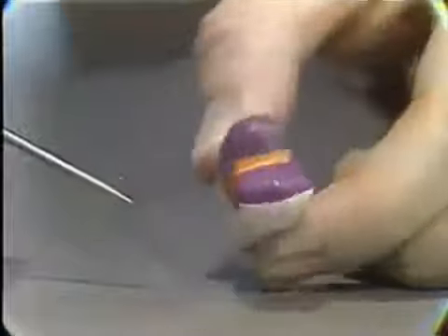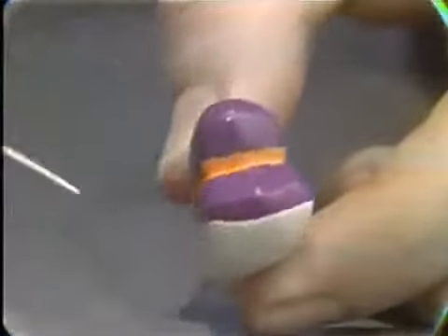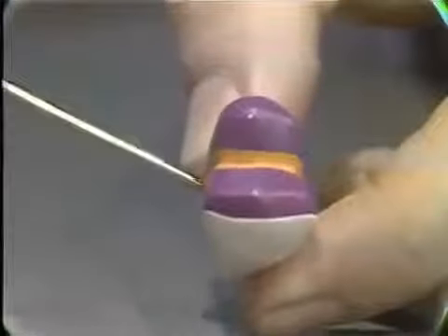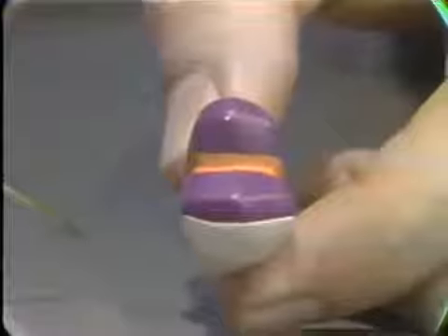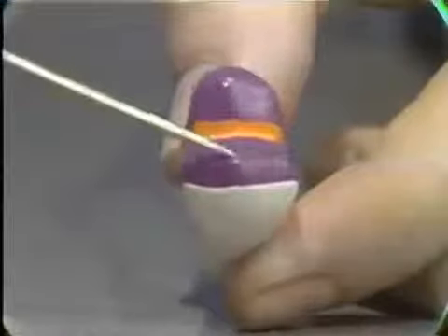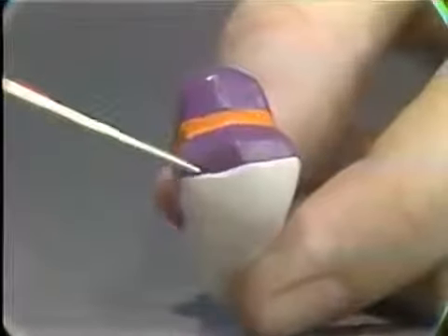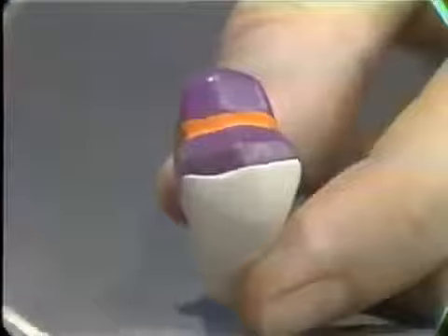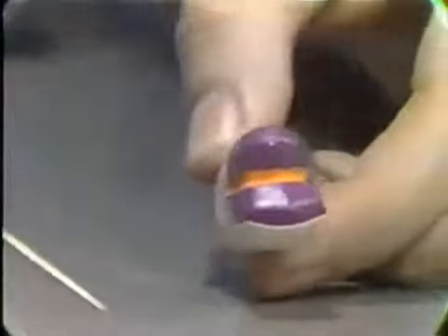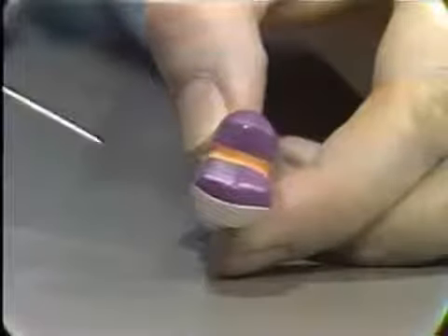As we have seen earlier in the diagram, it's the length of these grooves on either side and the degree of taper, the minimum degree of taper of these, that gives the essential strength to this type of preparation. You can see that the whole of the occlusal surface is covered and is protected right up to the margin of the buccal cusp along here. This then is the most conservative type of three-quarter crown with groove retention on the proximal and across the occlusal.